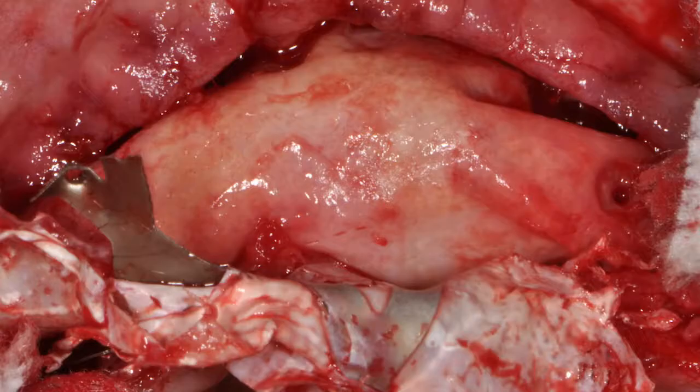The diagnostic phase is the most important one. Then the second goal would be to achieve a good tridimensional thickness of the bone to allow our implant to be inserted properly and to leave a nice buccal bone balcony.